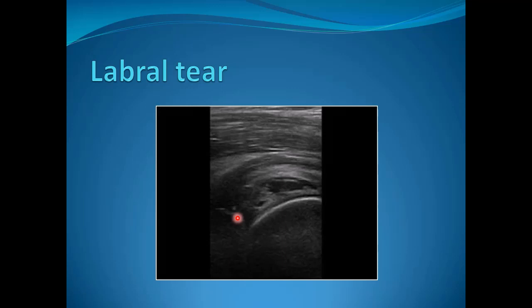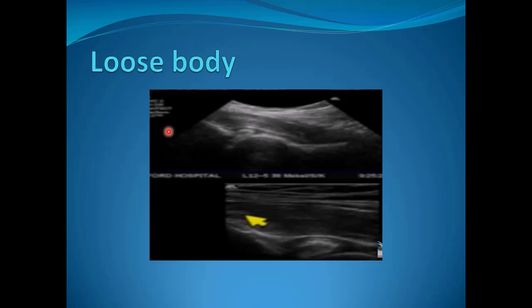This is an example of a joint showing some effusion where we can assess the labrum — we notice a small labral tear. Loose bodies can also be seen by ultrasound in the joint.